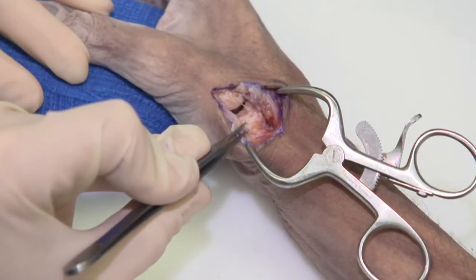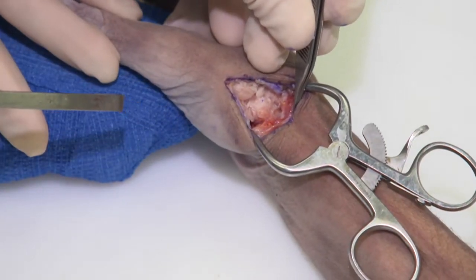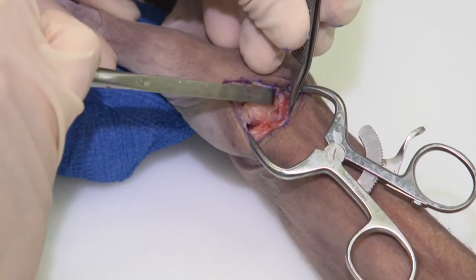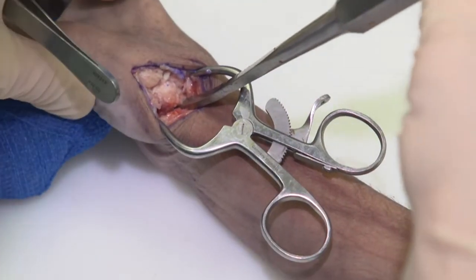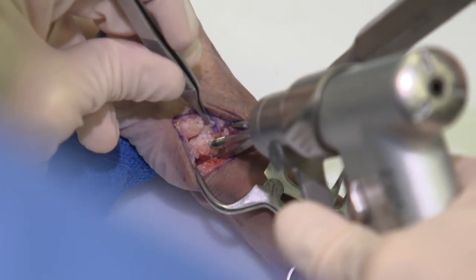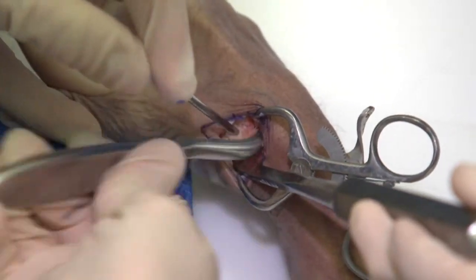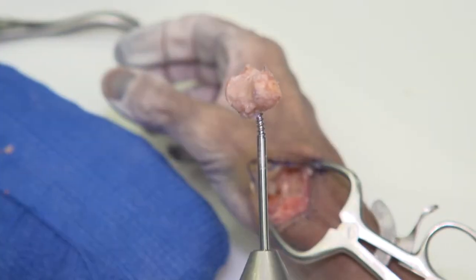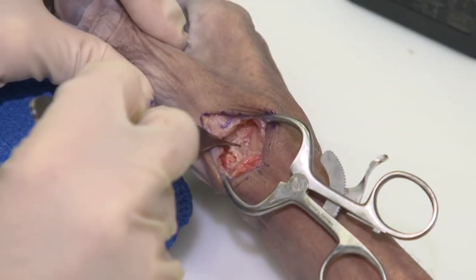You can see the concavity of the basal joint right here. To keep the radial artery from being injured, I would typically use a freer elevator here to insert on the opposite side between the scaphoid and the trapezium. Now we're going to use the trapezium pin and I am currently using the McGlamory elevator. This is the trapezium post-resection. This is the flexor carpi radialis.